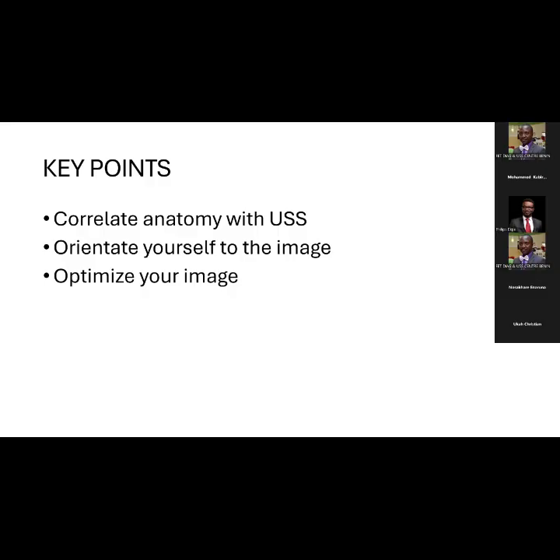Okay. It depends on if you are measuring the endometrial thickness for the purpose of following up a woman you are managing for infertility. Usually you do it in the mid-cycle period. So you are looking out for the endometrium that is trilaminar, has a midline, and then the thickness is measured from the anterior wall to the posterior wall. So you're going to measure from the anterior wall across the midline to the posterior, and you do it at the widest part toward the fundus.